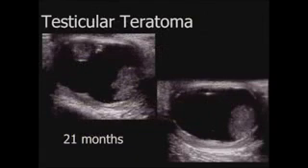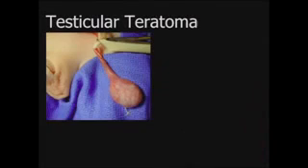So when you have a case like this, it's fairly typical. There's a thin rim of parenchyma here, and this is a large cystic mass with sort of little dermoid plugs. So when you suggest that diagnosis, the surgeon can offer testis-sparing surgery. And courtesy of my friend Dr. Ramajayanti, here is a particular case that he did. You have to treat these like a cancer operation. So this is done through the inguinal canal with delivery of scrotal contents and surgical control.